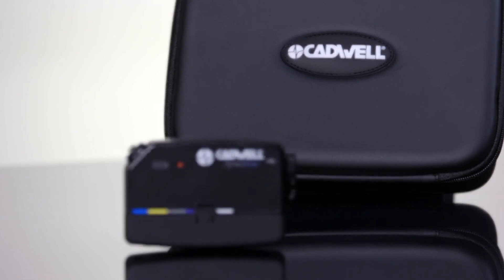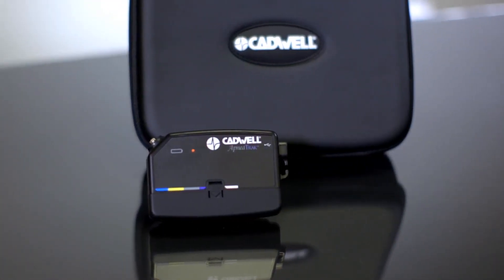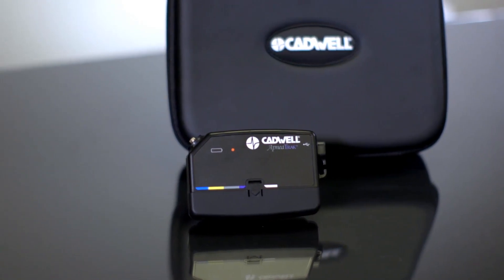Your healthcare provider has determined that you will participate in a home sleep apnea test. The Cadwell apnea track will collect data on your breathing and snoring while you sleep. If your provider gave you specific instructions, follow those instructions first.